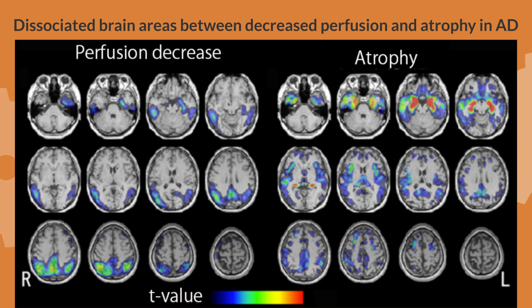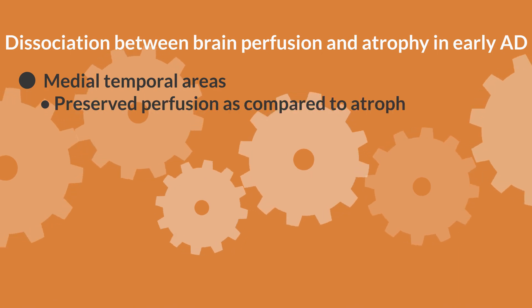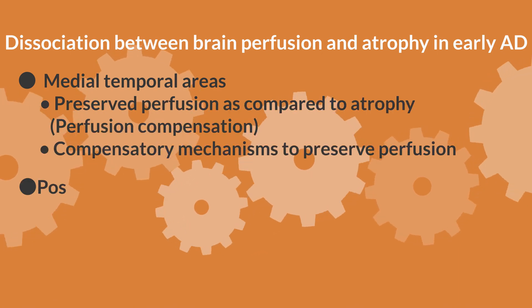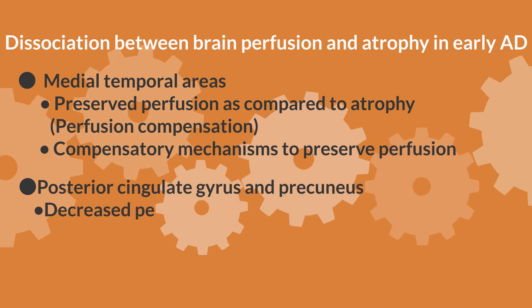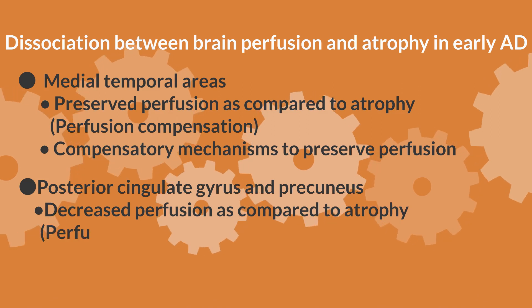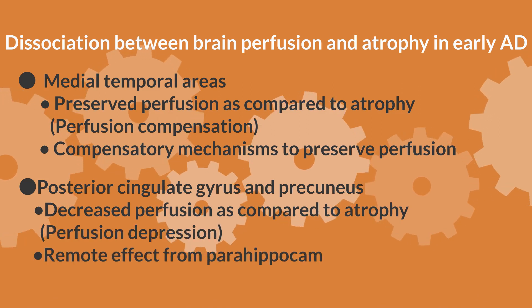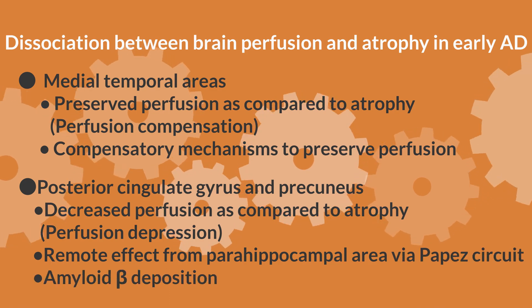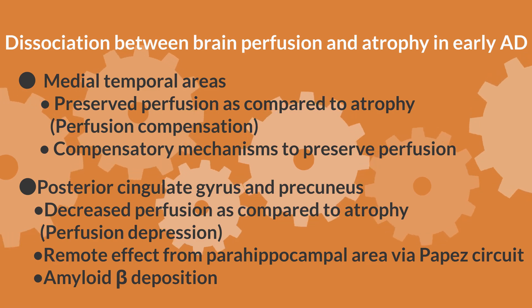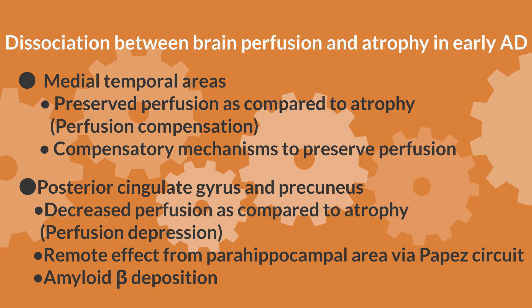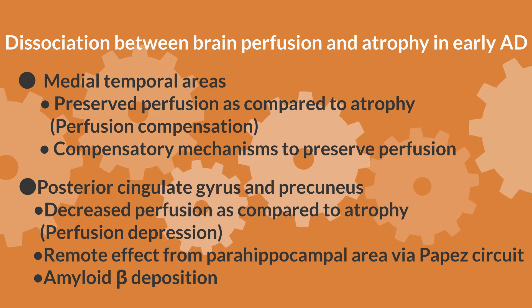In Alzheimer's disease, there is a discrepancy between the area of decreased perfusion and the area where cerebral atrophy is observed. A statistically significant decrease in perfusion is seen in the parietal lobe to the posterior cingulate gyrus and precuneus, while atrophy is more pronounced in the medial temporal lobe. In the medial temporal lobe, perfusion tends to be maintained compared to atrophy, suggesting a compensatory mechanism called perfusion compensation. In the posterior cingulate gyrus and precuneus, there is a marked decrease in perfusion compared to atrophy, referred to as perfusion depression, caused by amyloid beta-protein deposition and inhibition of perfusion due to remote effects from the parahippocampal gyrus via the Papez neural circuit.